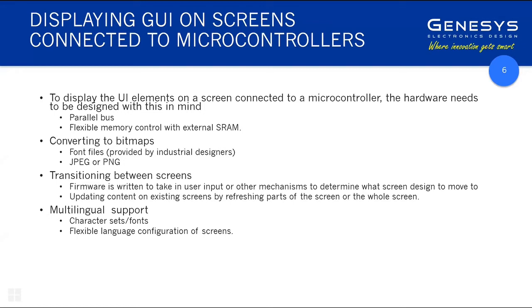All the software that is developed on that microcontroller was developed under the 62304 process and principles. So by definition there is no use of SOUP, and no use of SOUP means you can progress through the design and get it certified with a lot more ease and less risk of issues that arise from unknown software in your design.